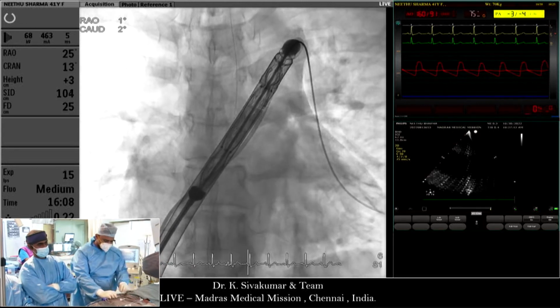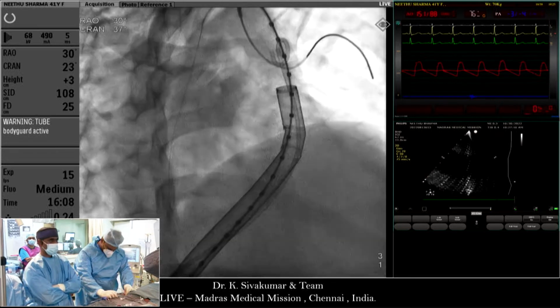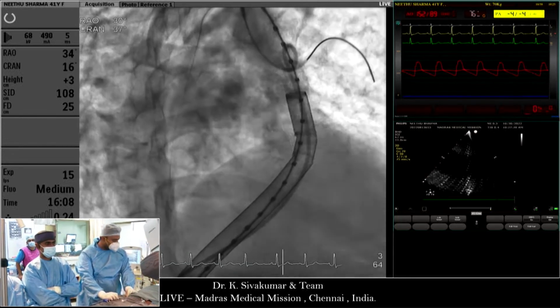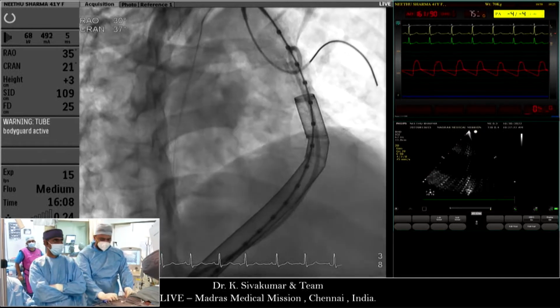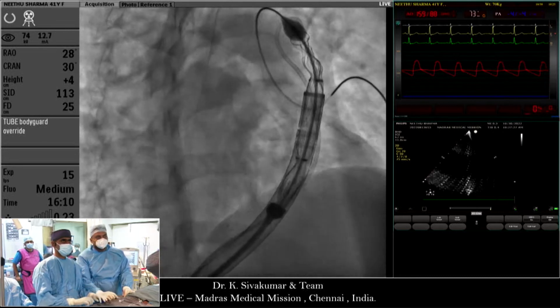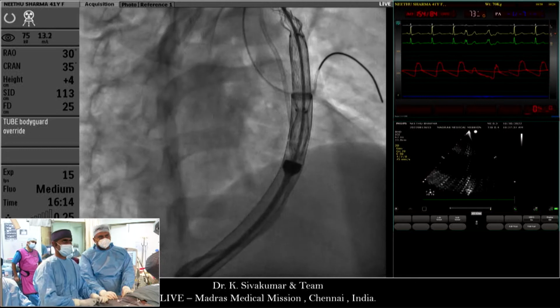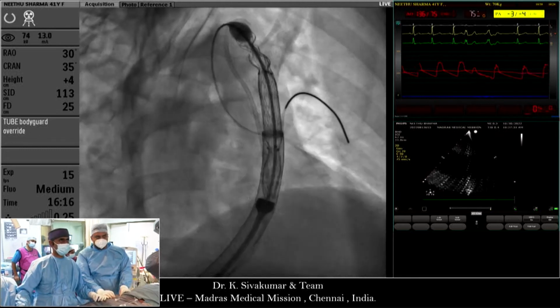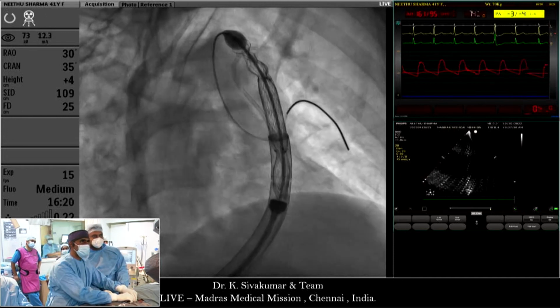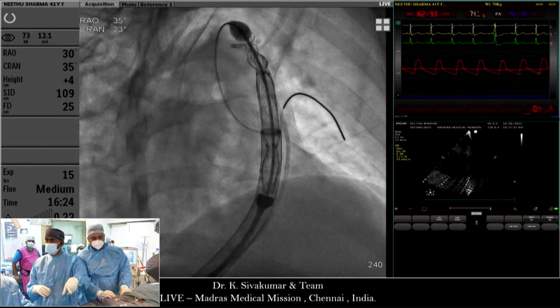And I truly agree now with what Shiva was showing on angios. So there was a discrepancy of 2 millimeters when you showed it, right? We do that at mid-systole to set the maximum diameter, the first 30% of the systole. It is not a pure systolic image. Usually this is very mobile and you need all the phases to see precisely where the diameter is the widest. That's why there was a discrepancy, I think.